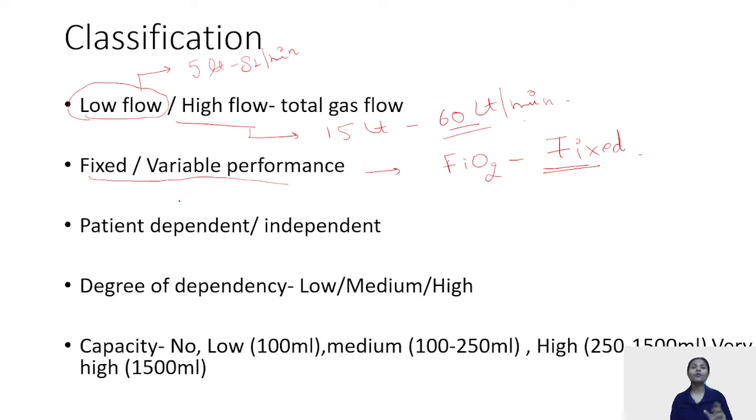Then last we come to capacity of a device. By capacity of a device, I mean how much oxygen reservoir the device has. By capacity, we mean oxygen reservoir. Like in some devices, we don't have any oxygen reservoir.